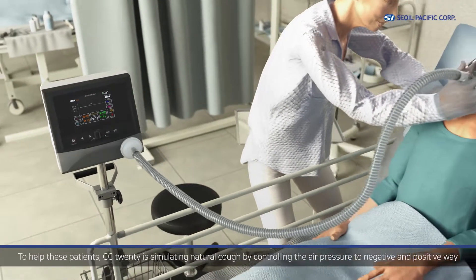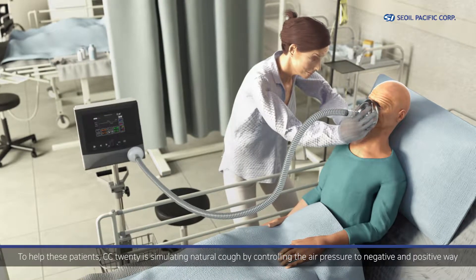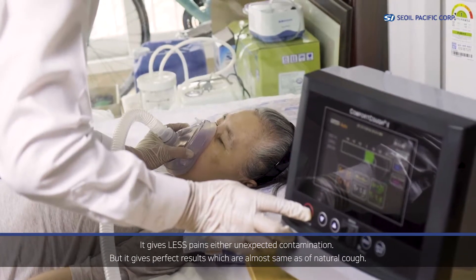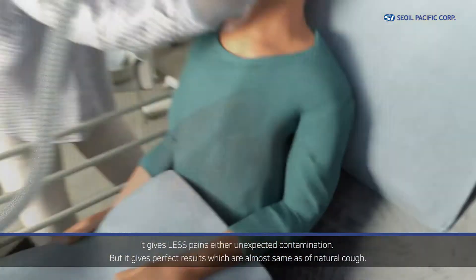To help these patients, CC20 simulates natural cough by controlling the air pressure in both negative and positive ways. It gives less pain and avoids unexpected contamination, but it gives perfect results, which are almost the same as a natural cough.